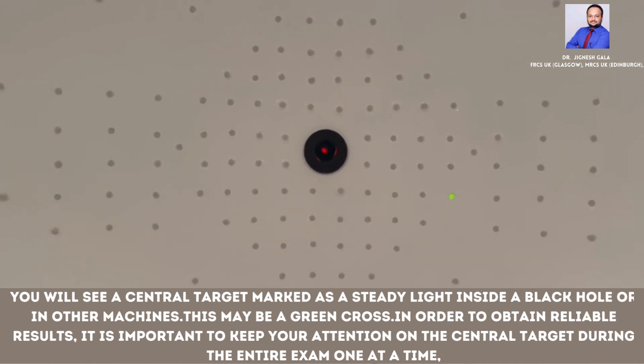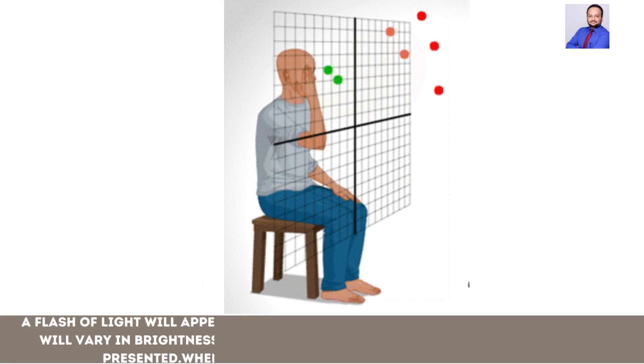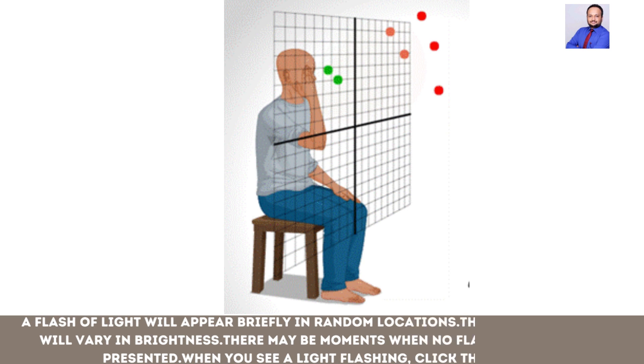One at a time, a flash of light will appear briefly in random locations. These flashes of light will vary in brightness. There may be moments when no flashes of light are presented. When you see a light flashing, click the button.